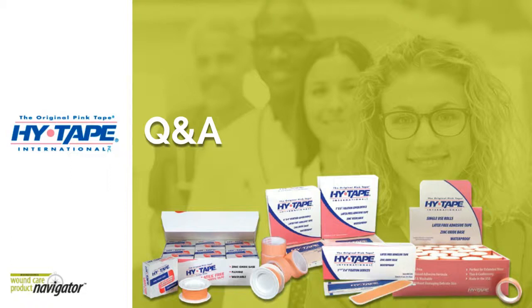How do you avoid tape tears or skin irritation from the edges of HyTape? When you remove the tape, as we said in the presentation, you would remove it at a low angle peel, low and slow back over the way the tape has been on the skin, preferably with the way the hair grows.